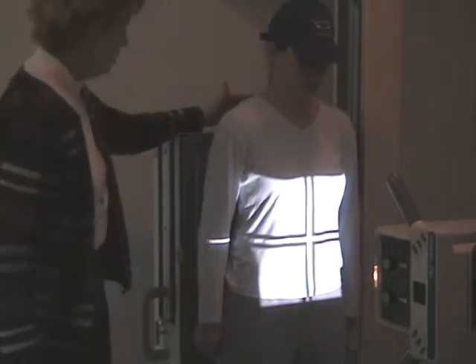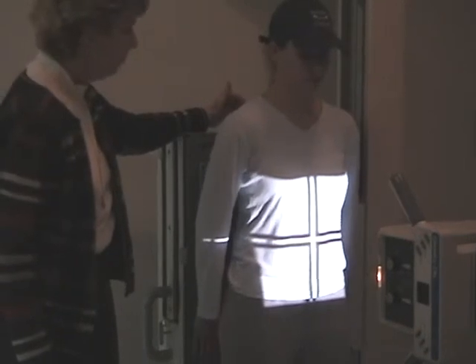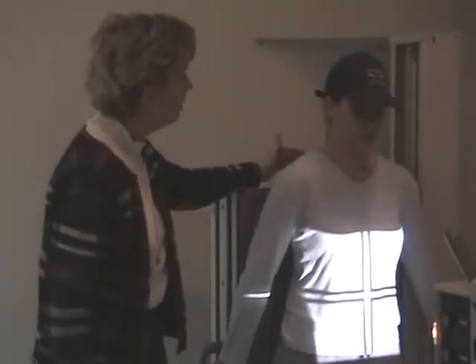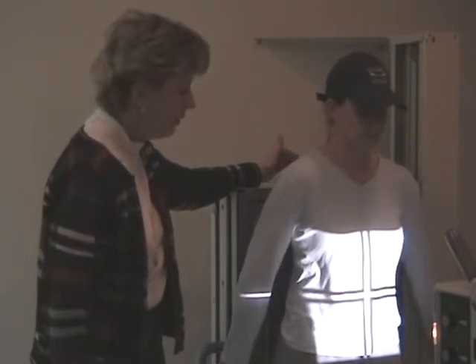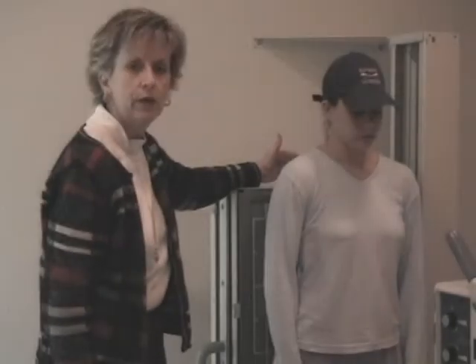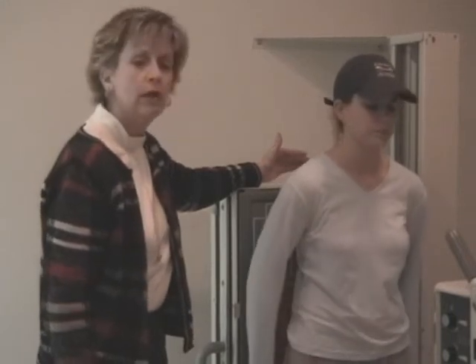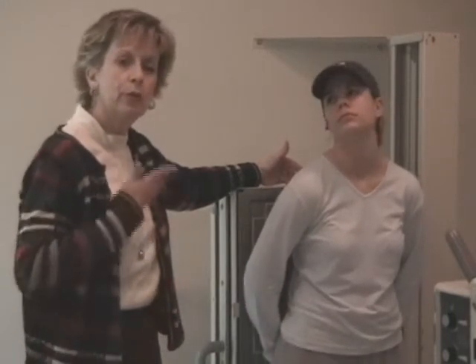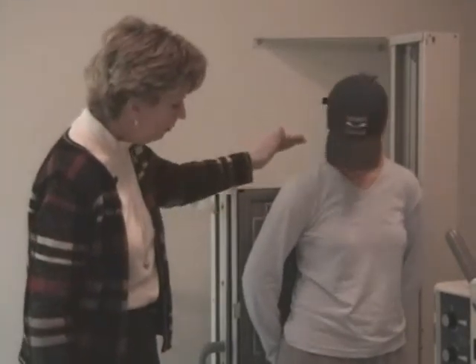Then I would give my patients instructions on how to breathe. If it's possible, try for the double breathing technique. Have your patient take in a breath, blow it out, take in another deep breath, hold this one in, do not move, and then you can make your exposure. Then allow your patient to breathe. We utilize a deep inspiration for the purpose of lowering the diaphragm, trying to make sure it gets on the upper edge of the film.